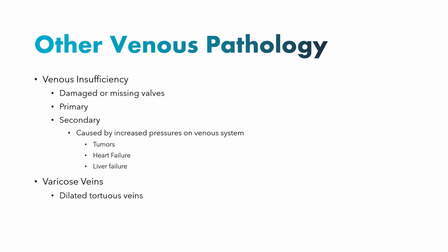And varicose veins are going to be dilated, tortuous veins that can be challenging to follow. And it can lead to things like caput medusae or other issues such as that. So this is where a lot of venous mapping and that type of thing comes in, but that's probably not something that you're going to want to spend the time doing in point of care ultrasound, as it can be very time consuming and challenging.